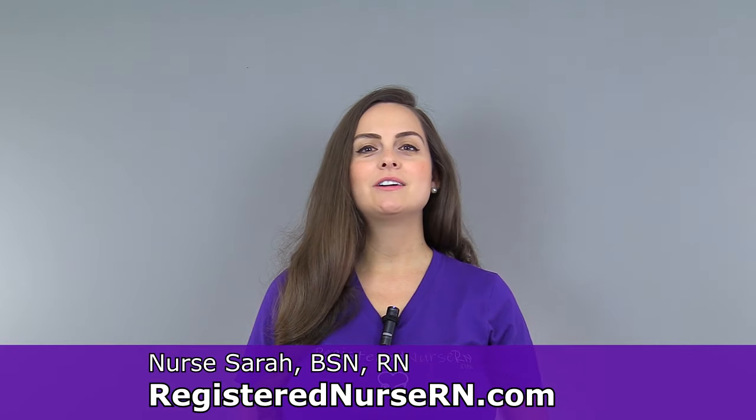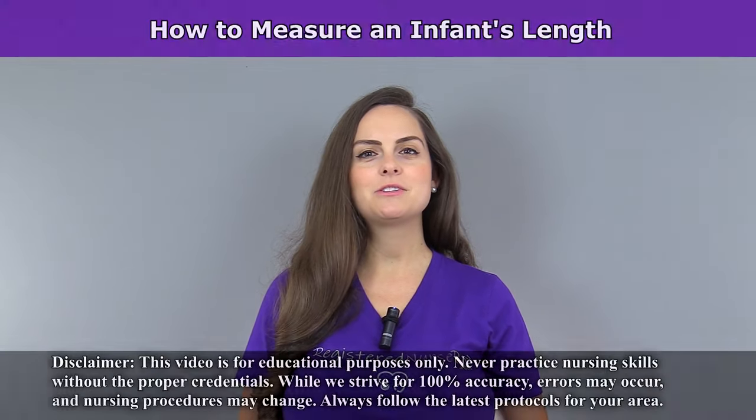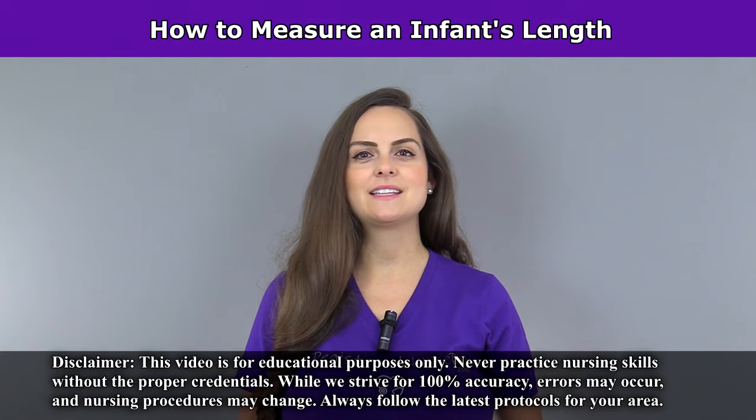Hey everyone, it's Sarah with Registered Nurse RN.com and in this video I'm going to demonstrate how to measure an infant's length.